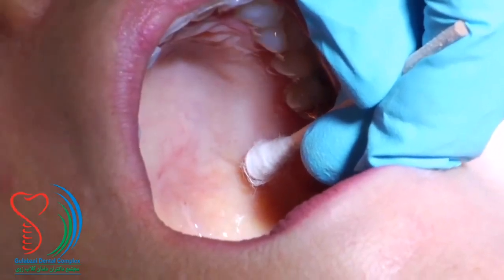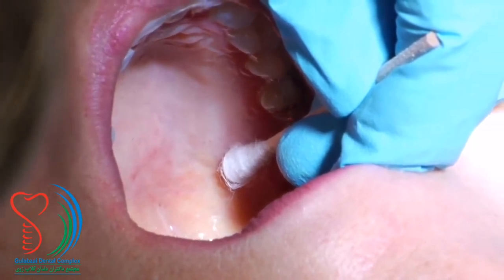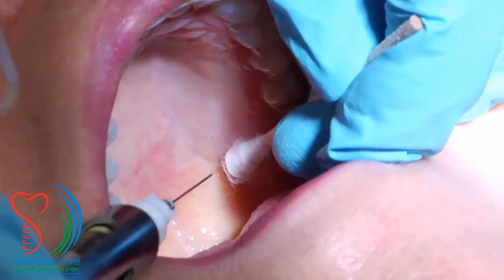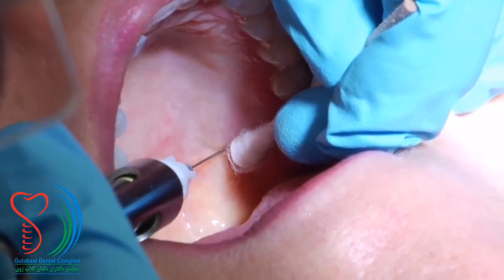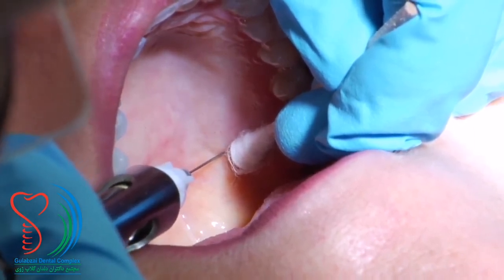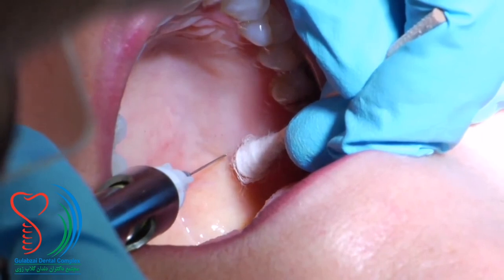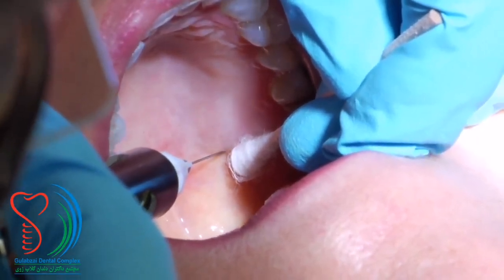You will be applying your pressure anesthesia with the cotton end of a swab after you've applied topical for a period of time. You'll place the bevel of your needle flat against the tissue, next to the pressure point or as close as you can get it, and hold the needle in such a way that you don't penetrate the tissue, but exert pressure on the plunger, so you're dispensing a small quantity of anesthetic over several seconds. As that takes effect, slowly let the needle penetrate into the tissue.